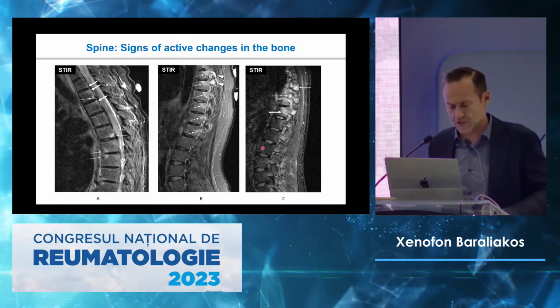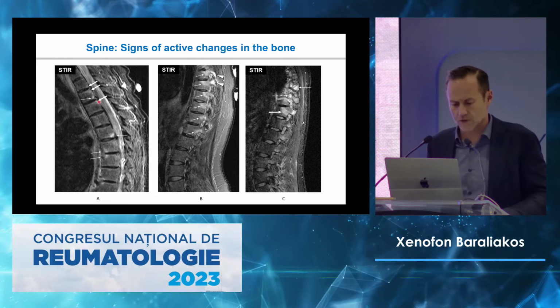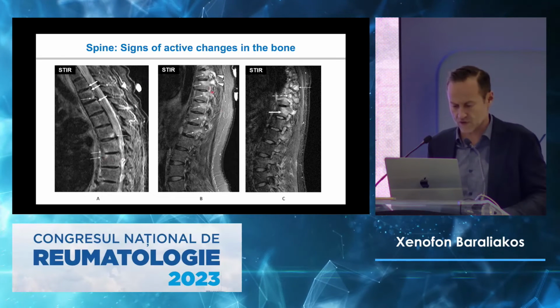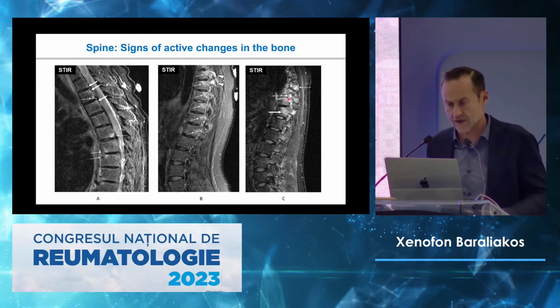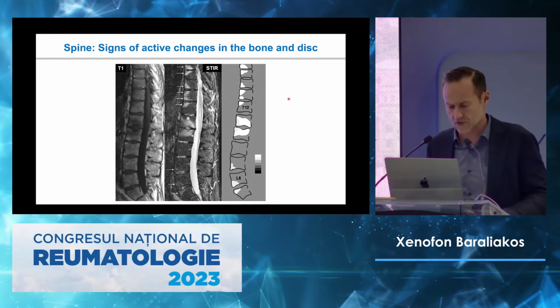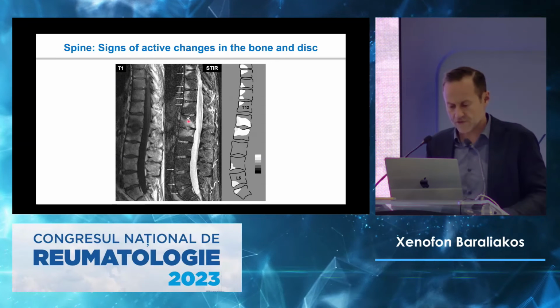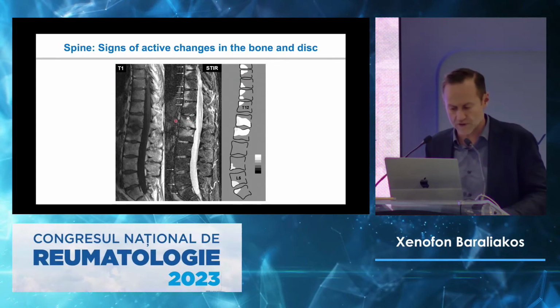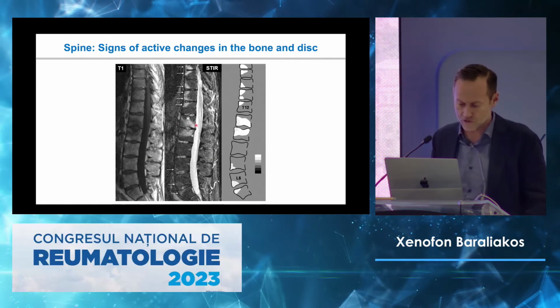What we've published is also the findings for the spine, where you have spondylitis posterior, you have spondylitis anterior, you have a lot of it, you have facet joint involvement, so it can really be activity everywhere in the bone. You see now the difference between the erosive osteochondrosis that I showed you before and the typical SPA findings. The SPA findings have more triangle form.